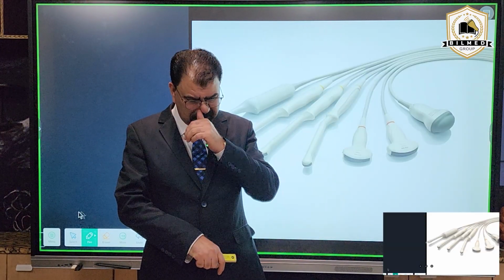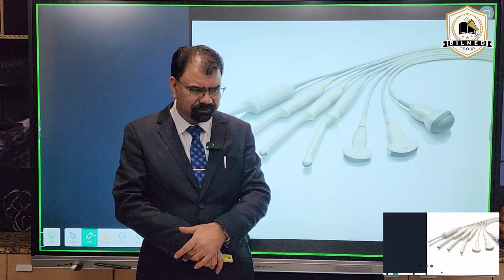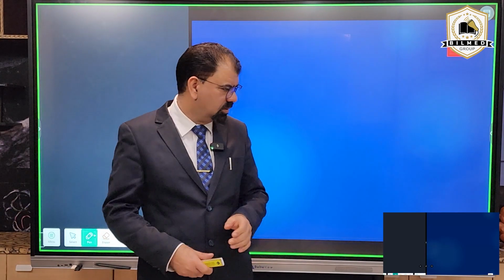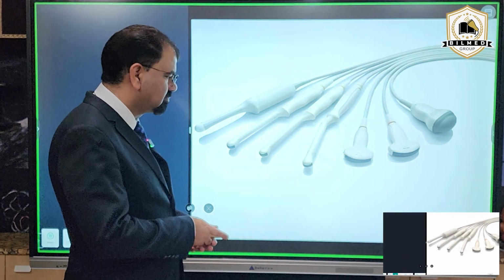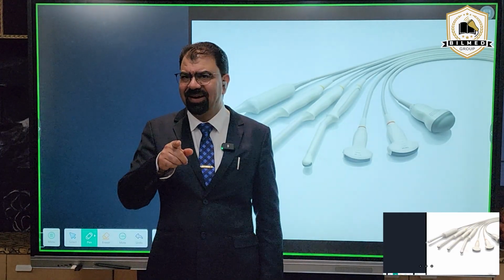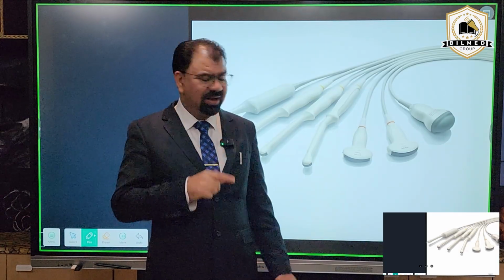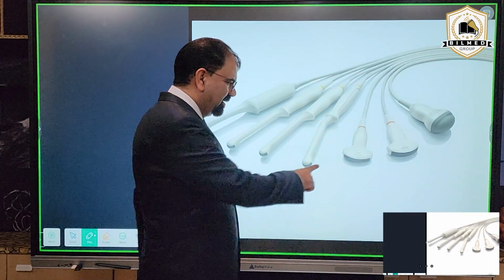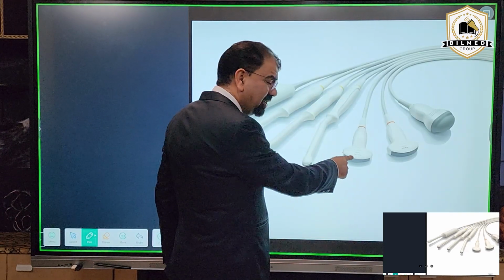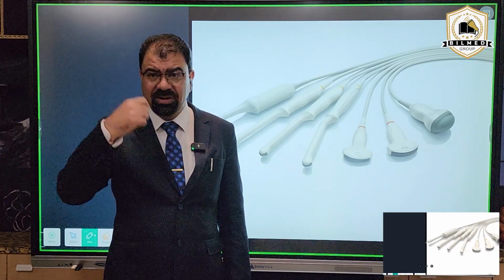depth, what to tell? You are right. Elaborate. So the depth, we can't use the vaginal probe, sir. Penetration, the depth is less. Penetration. Right. So here I have low penetration, and here I have more penetration, but I get penetration at the expense of resolution, at the expense of resolution.